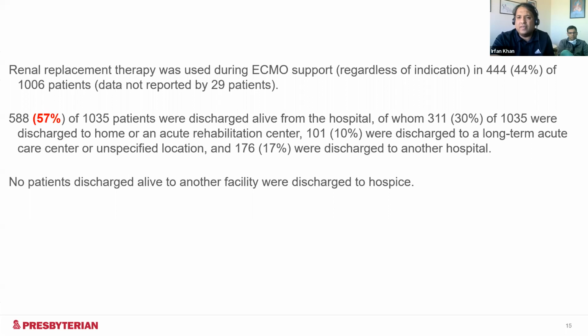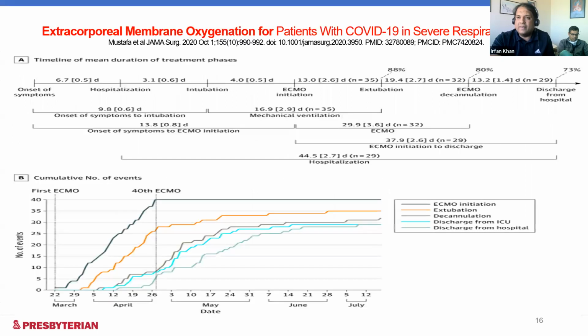So that is huge. So what we learned from these two studies is survival is somewhere around 50 to 55%, sometimes even 70% depending on the center. So that's a good thing. So you can continue offering this, even though it's long, so this is something that we took back to our nurses, our bedside nurses, perfusionists, specialists, making sure that the morale remains high.